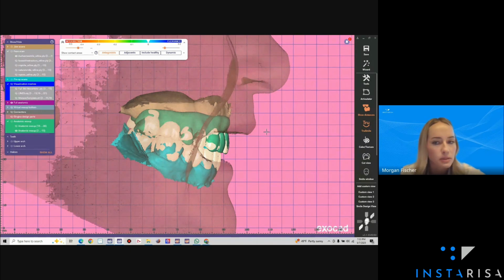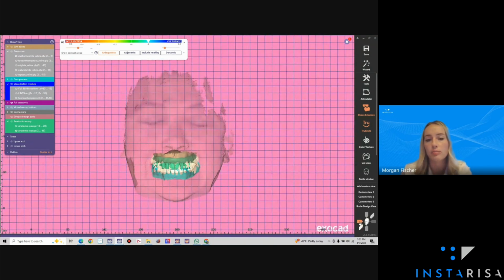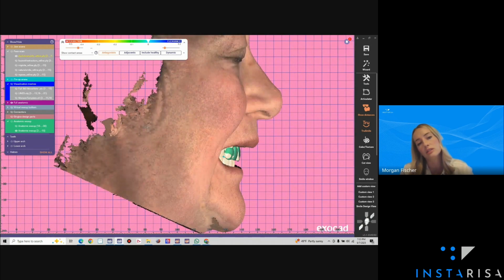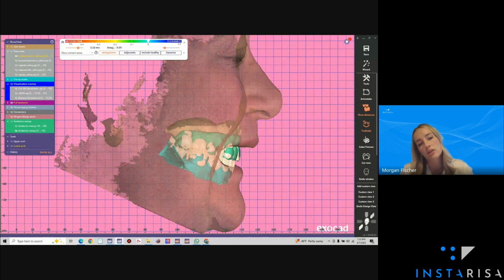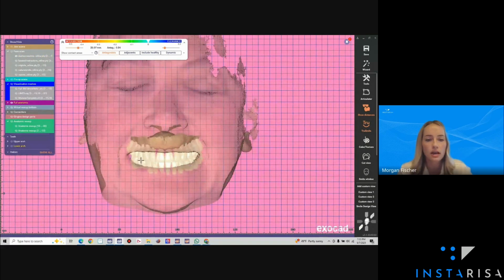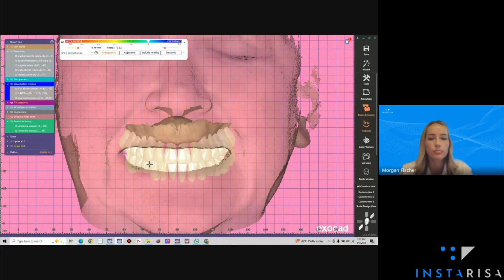But yeah, just making sure that the lip support looks good. I think we're going to be good to bring her in a couple millimeters. And then, yeah, looking at the occlusal plane from the side profile as well. So just making sure that we have nice curvature going upwards into a nice curve of Spee, back into the ear there. So that's a lot that goes into the proper pre-op design.